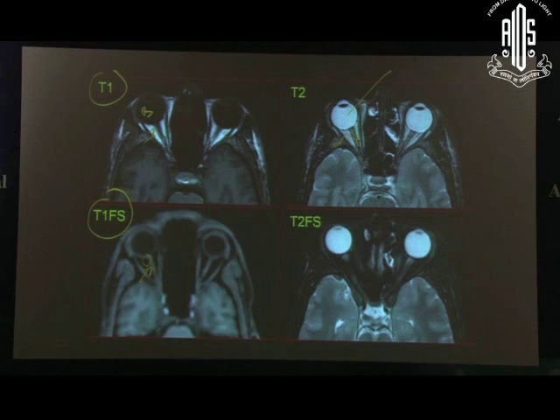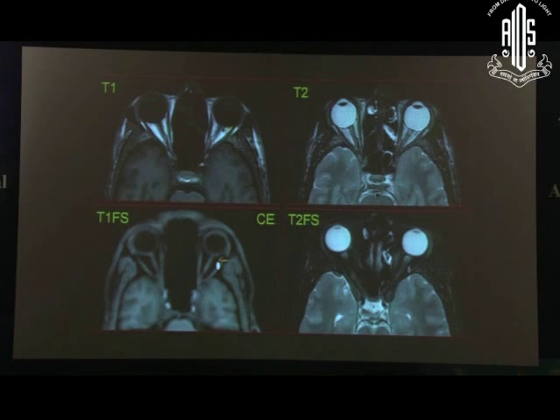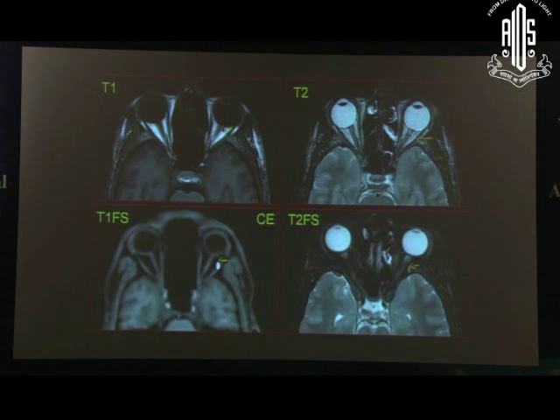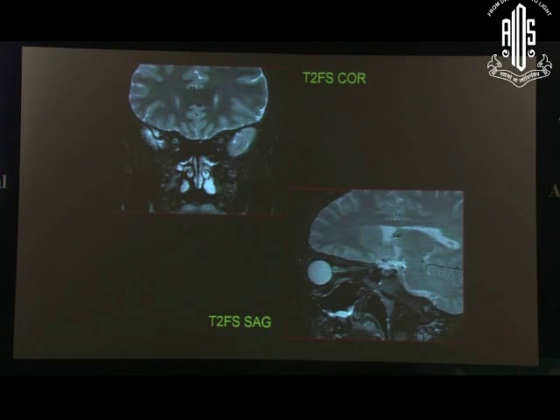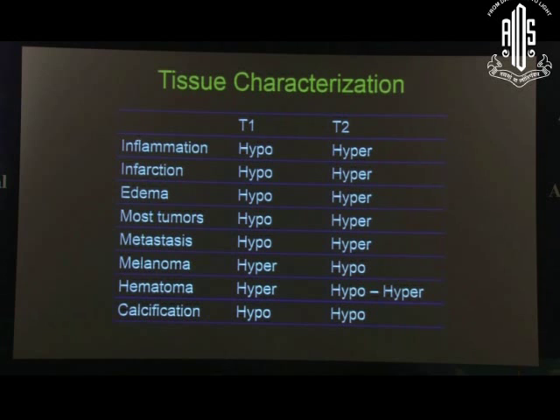In T2 also, you can suppress fat and look at the intraconal structures carefully. A tumour that is white can be made very evident by fat suppression; without suppression it merges with the background. You can have similar coronal and sagittal images as well. T1 always gives you anatomical details and T2 gives pathological details. For various pathologies there are different T1 and T2 characteristics — inflammation, infarction, oedema and most tumours are hypo on T1 and hyper on T2. In fact almost everything is hypo on T1 and hyper on T2, except melanoma, haematoma and calcification.